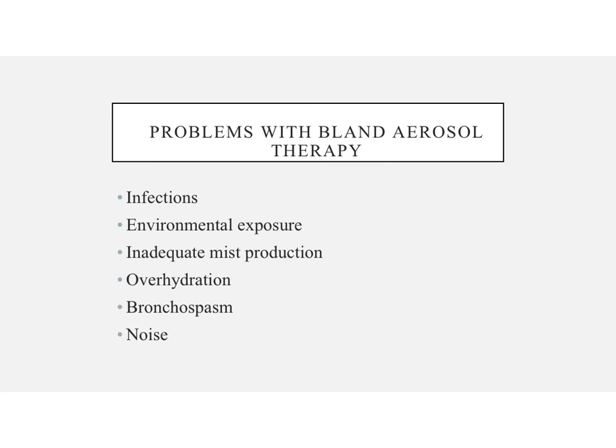Inadequate mist production is another problem we can see. That's actually a problem with all humidification systems. So we need to be able to troubleshoot our large volume neb, our passover humidifier, our bubbler to make sure that they are getting the proper flows and the proper humidification. So with pneumatically powered large volume nebs, it can be caused by an inadequate input of flow that is driving the gas into the nebulizer. So you want to check and make sure that the flow setting is on properly and that there are no loose connections.